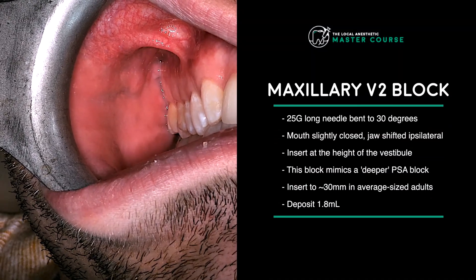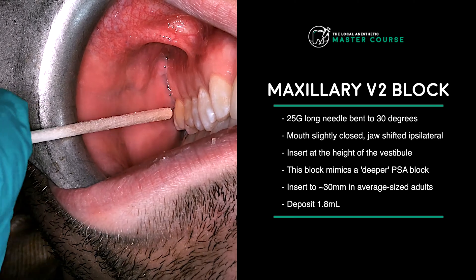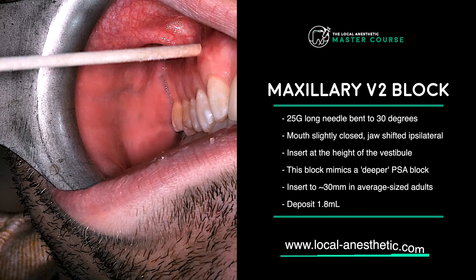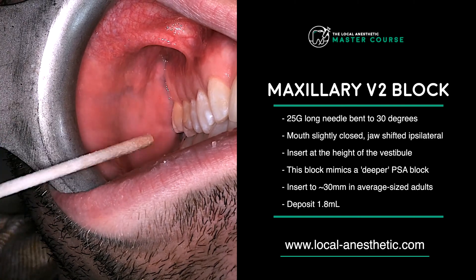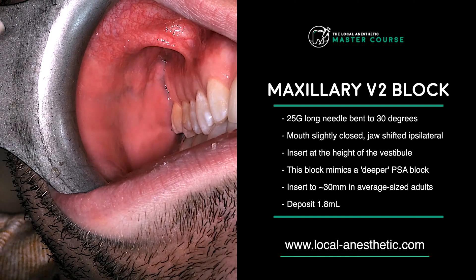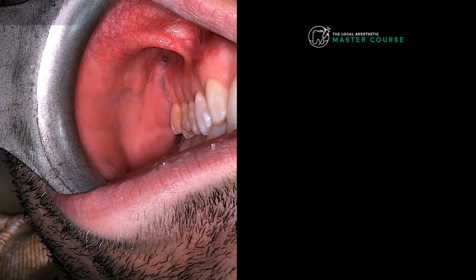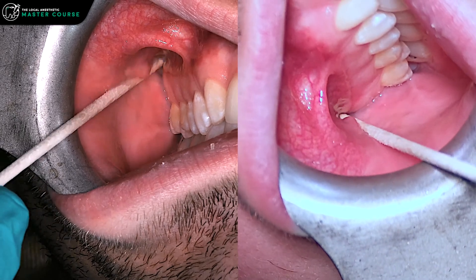Another block that you might find super helpful: if you're extracting lots of teeth in the maxilla and don't want to do a whole bunch of infiltrations, you could do the PSA like we just talked about, or you could do a maxillary V2 block, which is another underutilized injection. It's essentially a PSA block, only the needle penetration is a bit deeper.